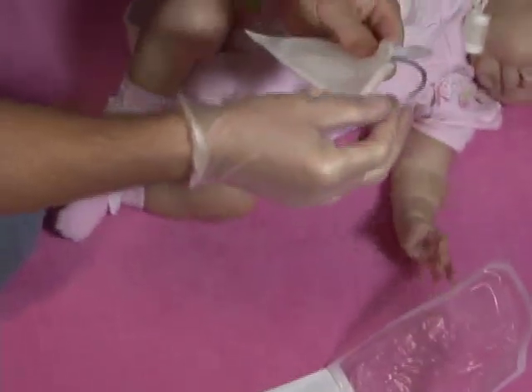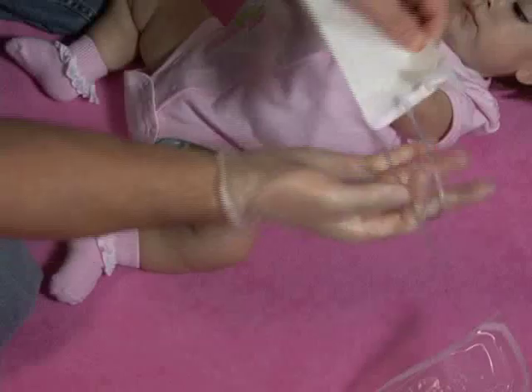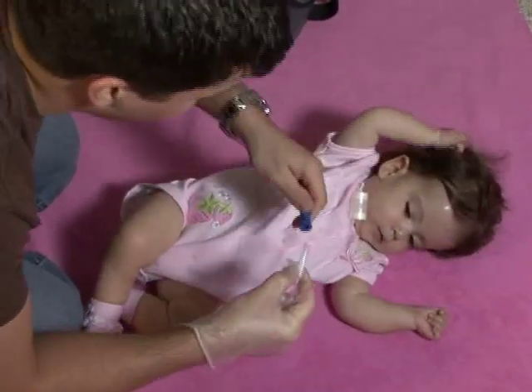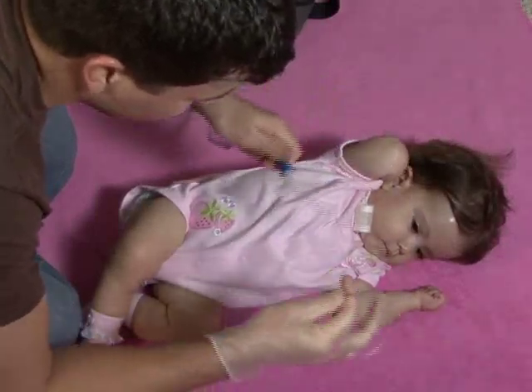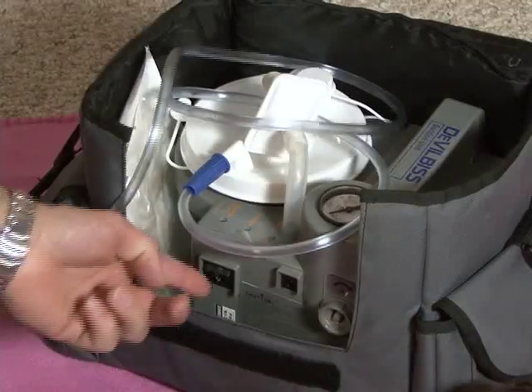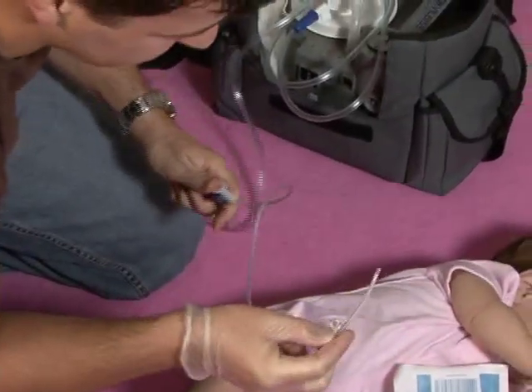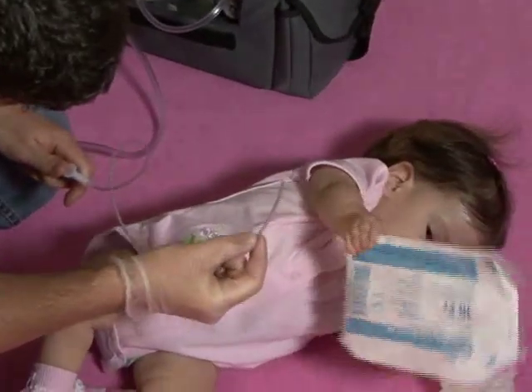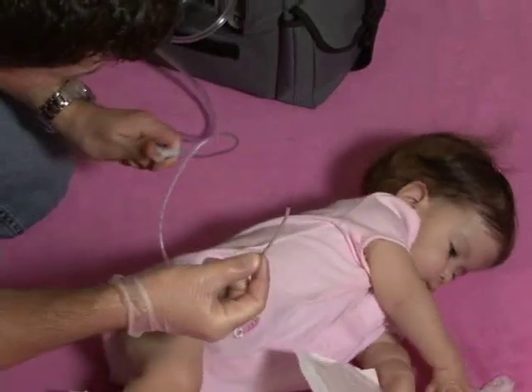With the sterile glove, grab hold of the tip of the suction catheter. Twist the remainder of the catheter around your gloved hand. Your free hand can then bring the suction tubing to the end of the suction catheter and push it in. Turn the machine on with your clean hand. If your suction catheter has numbers on it, you can place your gloved thumb just above the measured number where you know you should stop, so that you will not insert it too far.